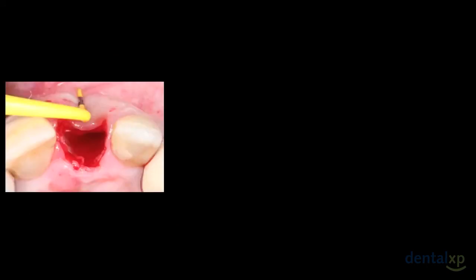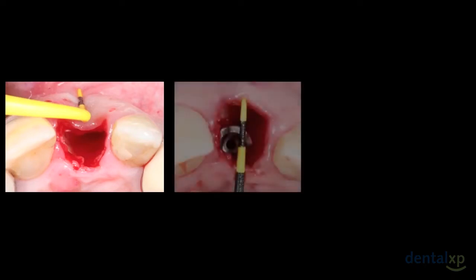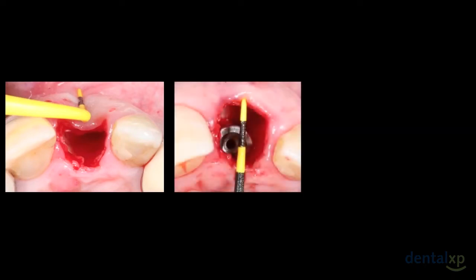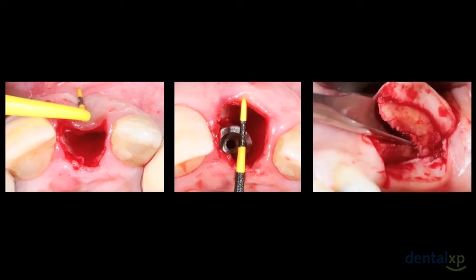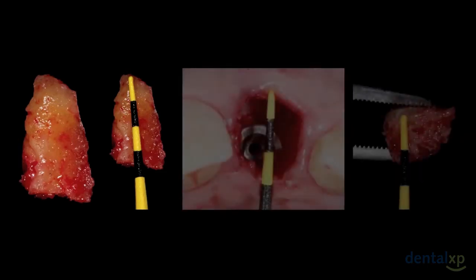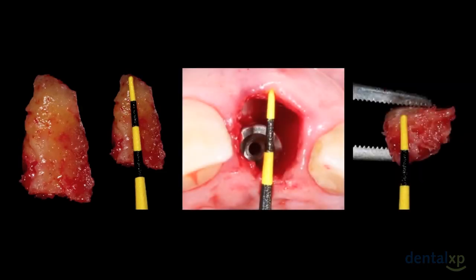We can see here a total absence of the buccal bone wall. Here we have the defect to be reconstructed after platform-switching implant insertion and harvesting of a bone graft from the left tuberosity using a gouge-shaped chisel. After reshaping the bone graft in height and width, sometimes we can harvest the bone graft with a thickness compatible with the gap dimension, as in this case.